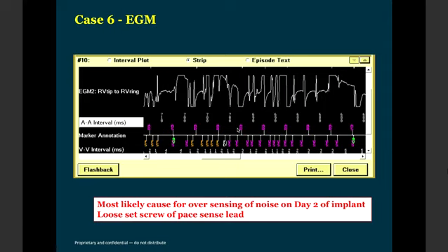Not only that, during the time of extraction, let's say this patient comes with an infection 10 years down the line, it is at the coil level where there is maximum adhesion. So with the SVC coil, there will be severe adhesions between the lead coil and the SVC itself, and extraction becomes technically very difficult should there be a reason to explant the device during follow-up. So for the reasons that I told you, a single coil is what we prefer these days in most of our implants. What was the first question?